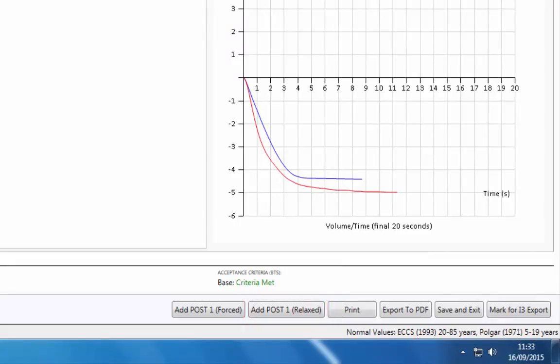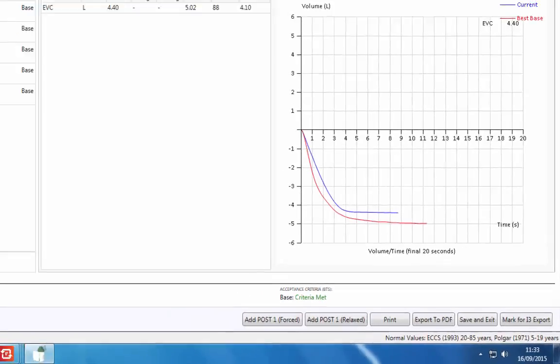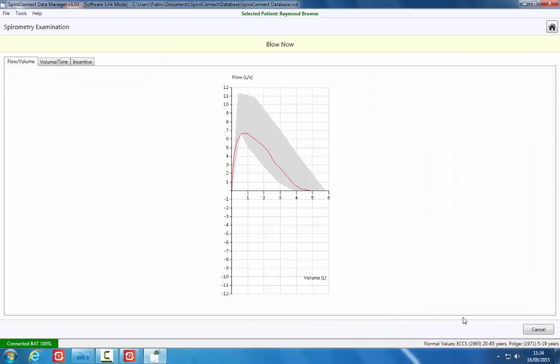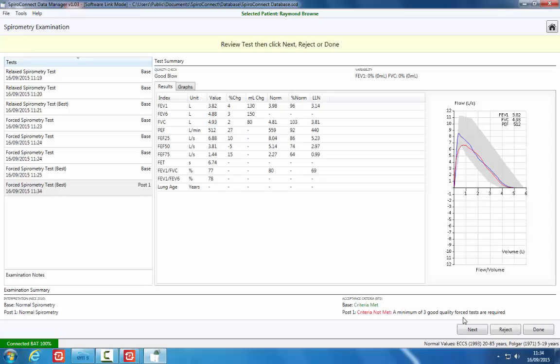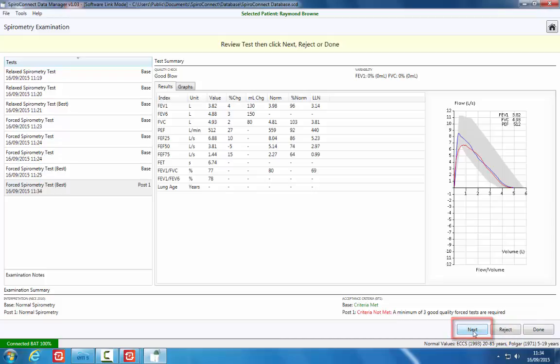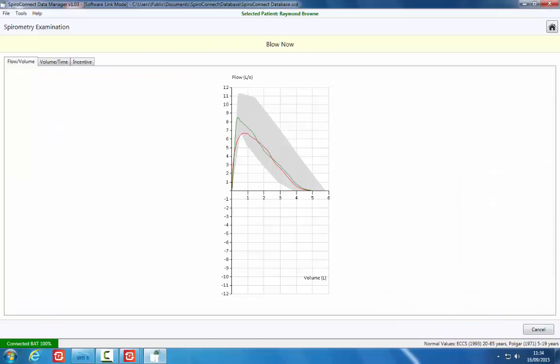Or, if preferred, you can skip these and move straight to the post forced tests by clicking the Add Post 1 Forced button. As previously seen, if the blow was not acceptable, click the Reject button; or, to accept the blow, click the Next button. A minimum of three blows of acceptable quality should be performed.